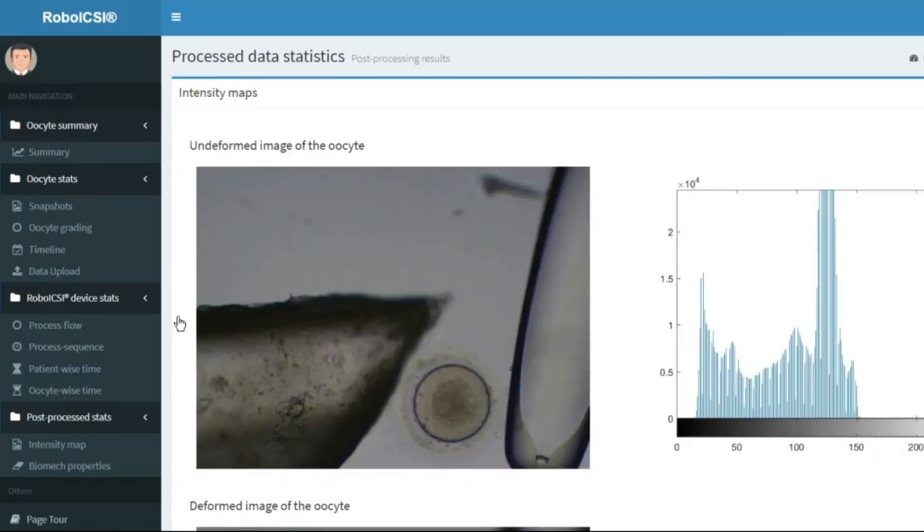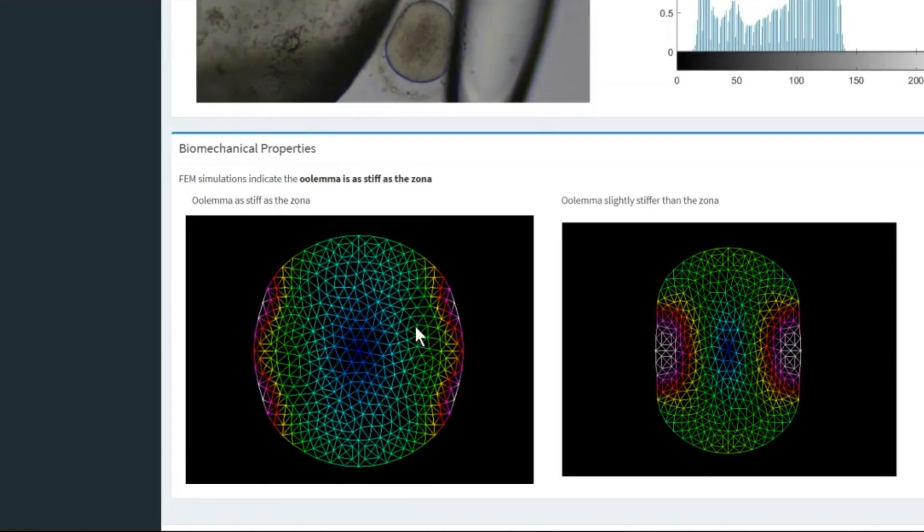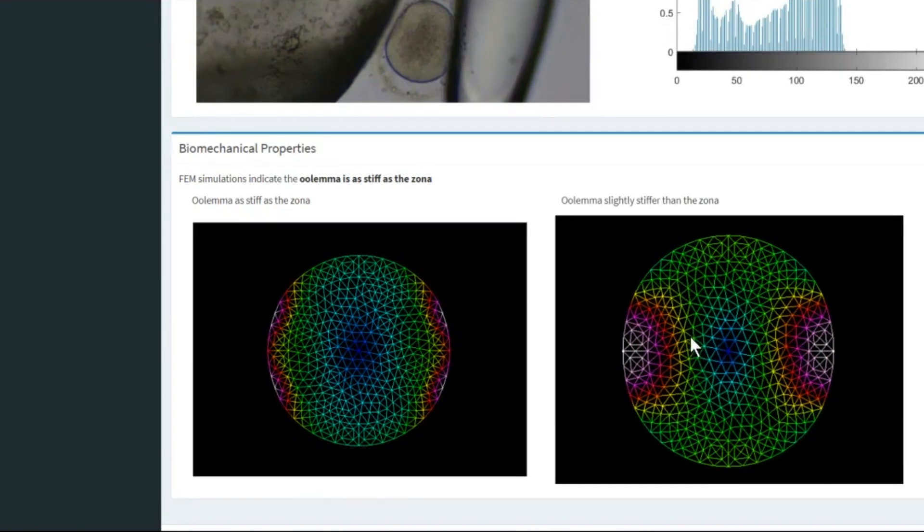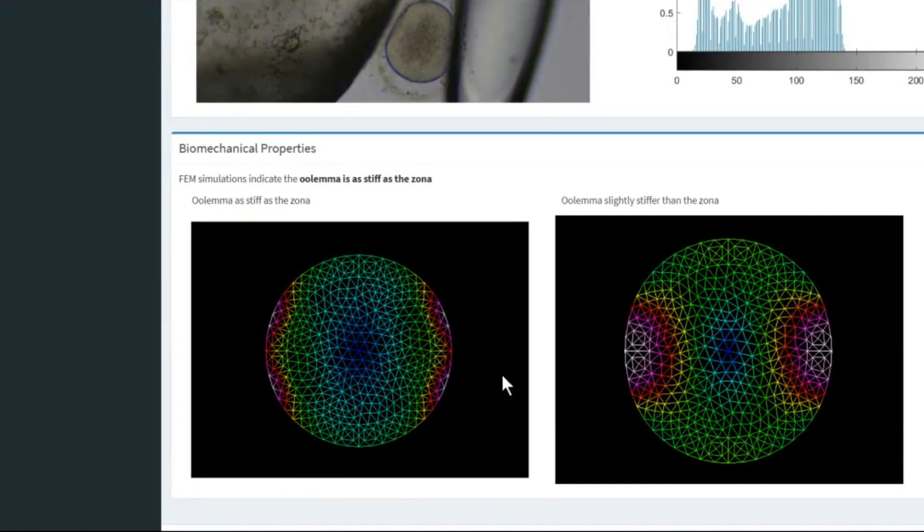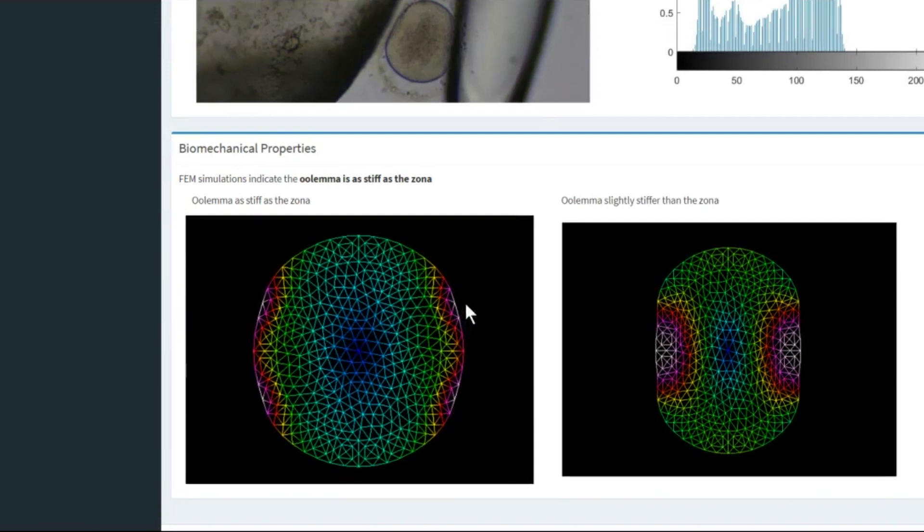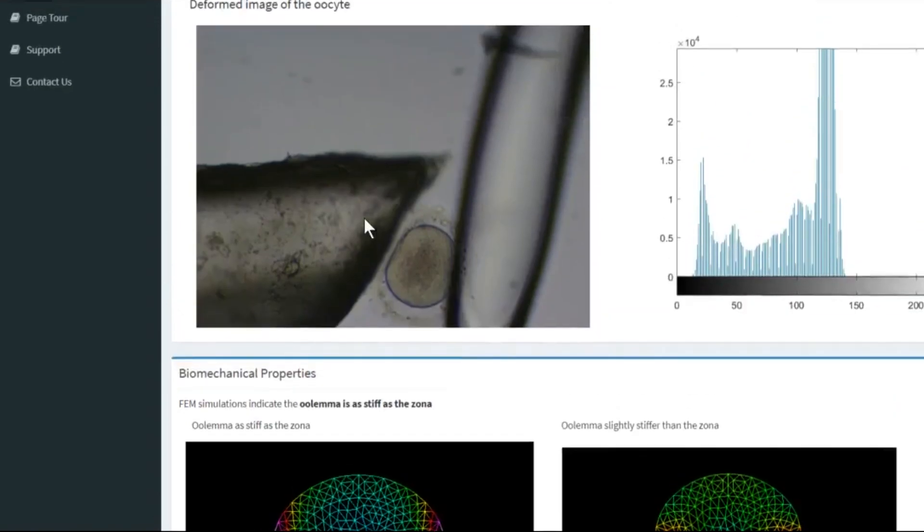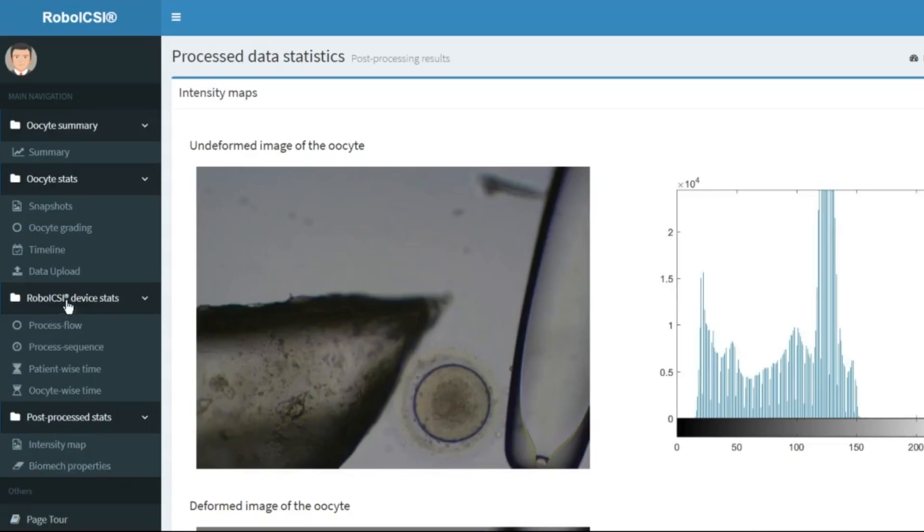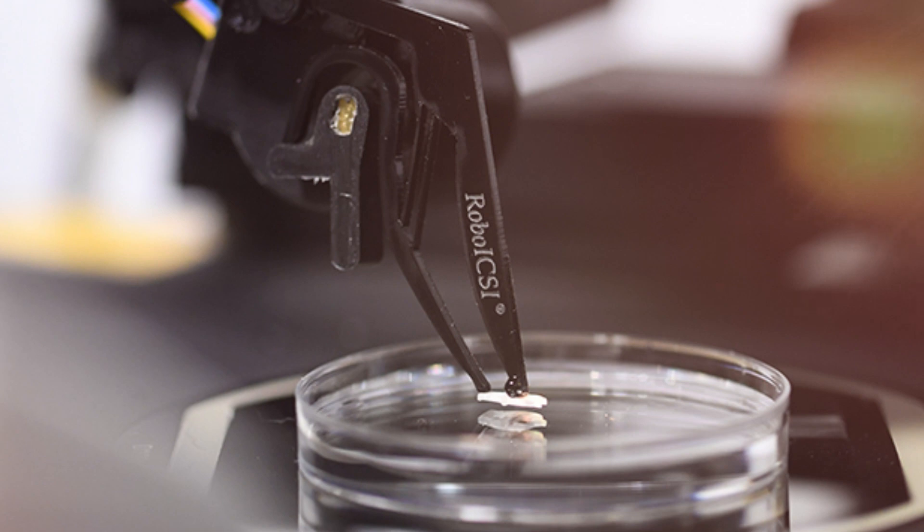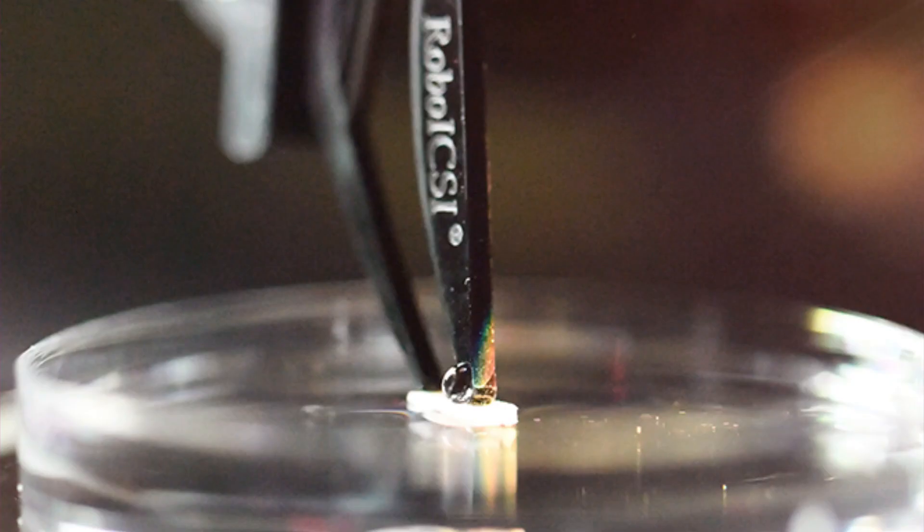Due to its novel design technique, Robo-ICSI can also help estimate biomechanical properties like oocyte stiffness and funneling characteristics. These properties possess information about the health status of oocytes and embryos. Now, with no additional effort, we will know more about the oocytes.